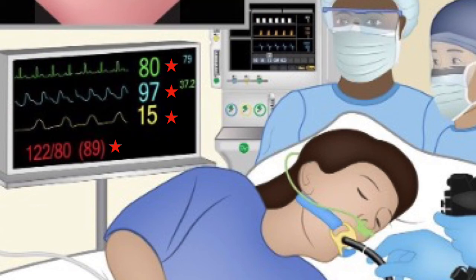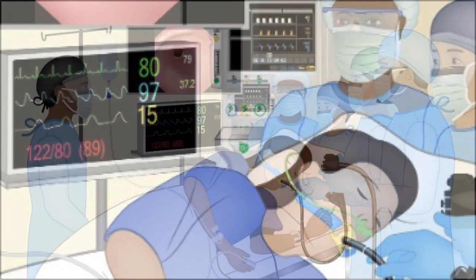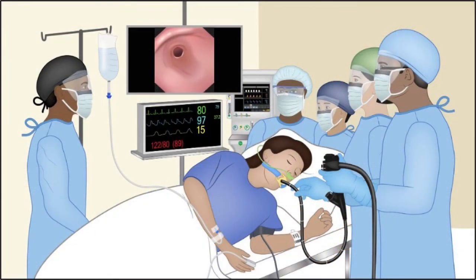And they also make sure that the patient does not aspirate the oropharyngeal secretions. As far as the endoscopist is concerned, he should take care to avoid the risk of perforation to the gut and the risk of causing bleeding.